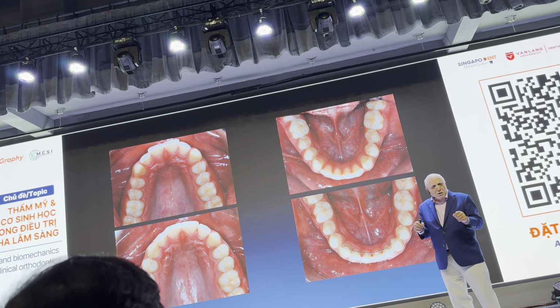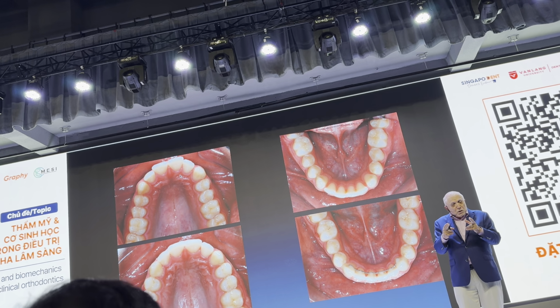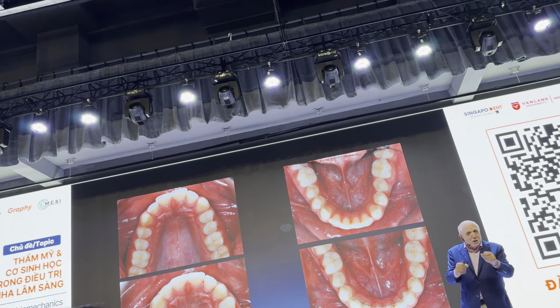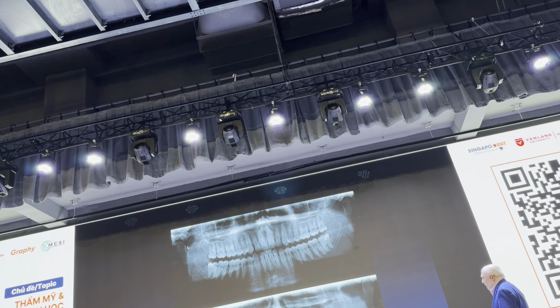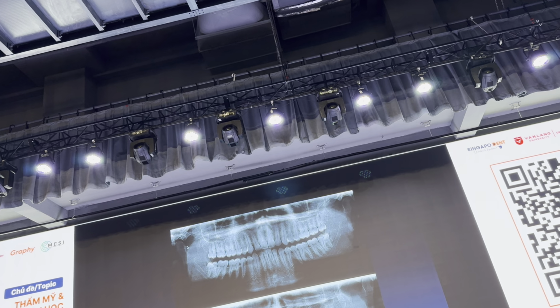None whatsoever. I was lazy at one time, and I would just cut the wire and just put it there, and then patient would show up with a lot of problems. So you don't want to do that. Don't create force in the wire in your patients. Again, long axes of the teeth have to be pretty parallel.